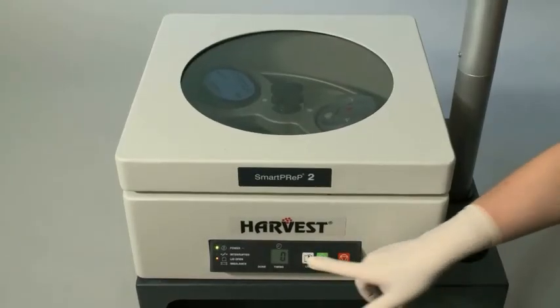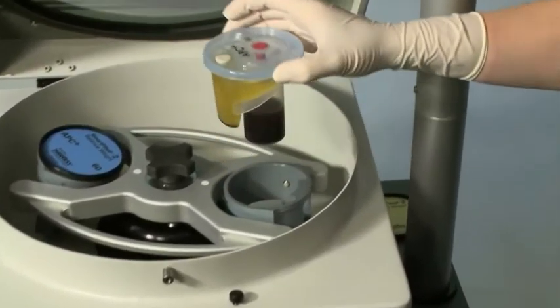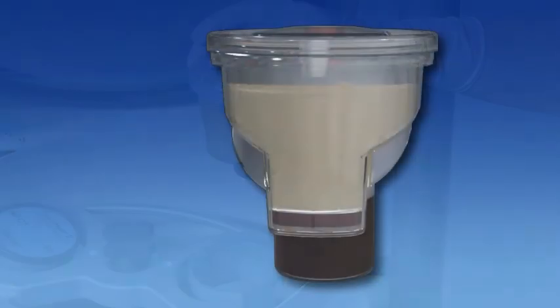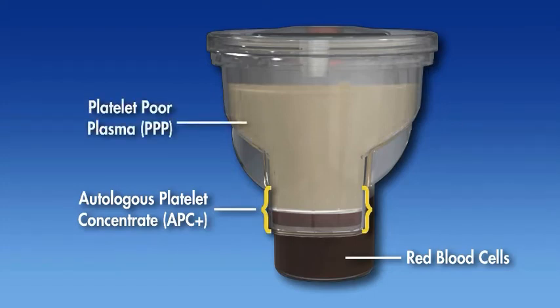Press the white lid button located on the front panel of the SmartPrep 2 system. Remove the process disposable. Avoid tilting, dropping, or shaking the process disposable as this can prematurely mix the separated components. The blood chamber of the process disposable contains the packed red blood cells. The plasma chamber contains the platelet concentrate, a button-like precipitate, and platelet-poor plasma supernatant.